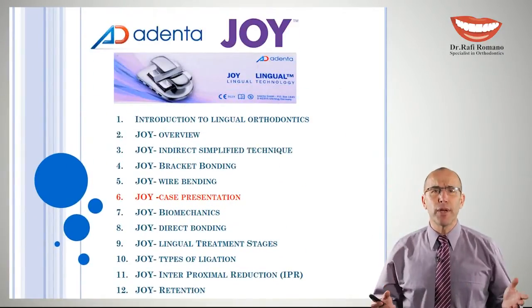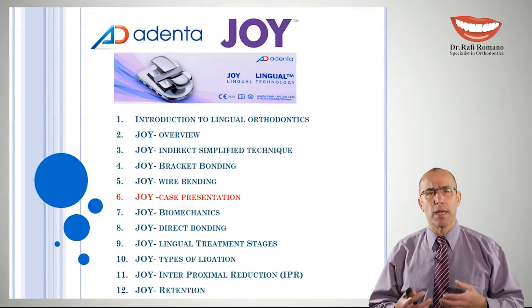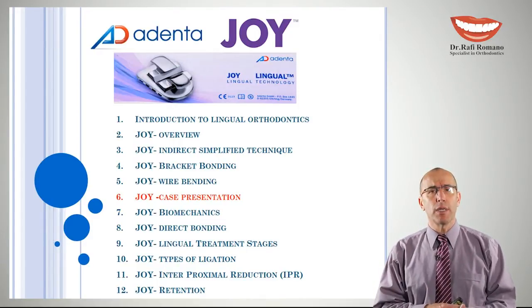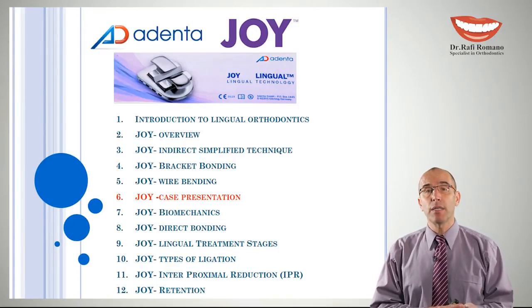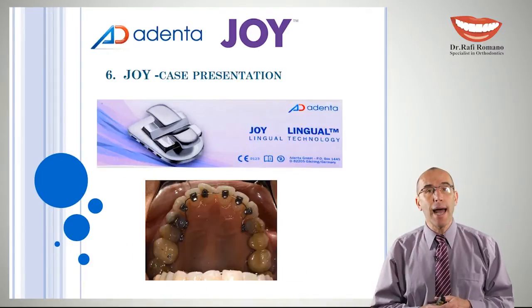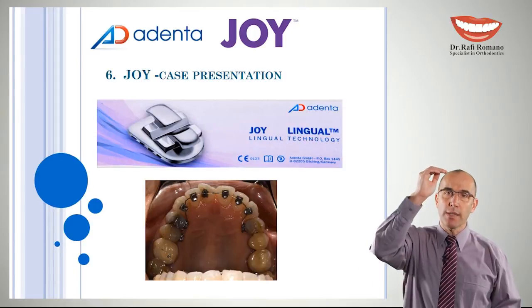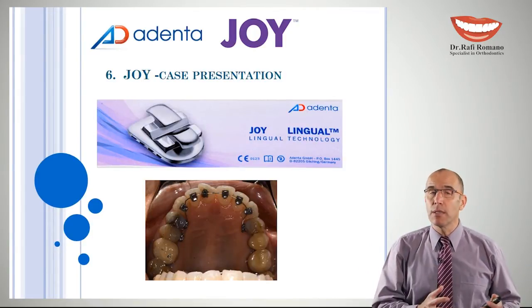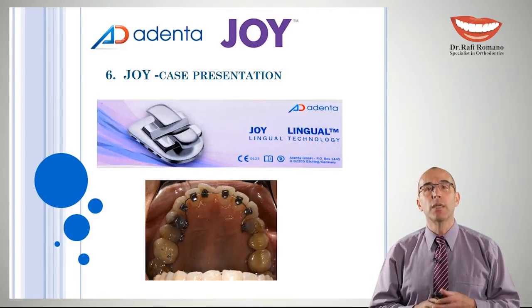We have already surveyed the overview of the parameters and the advantages of the bracket, how to do indirect bonding, how to do the bonding in the mouth, and we even discussed all the bending of the wires in the mouth. Now let's pick up a case and go step by step in this case, of how I proceeded with the bending of wires and the bracket bonding.